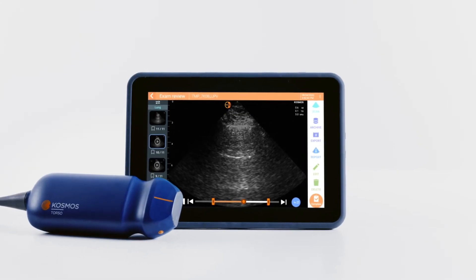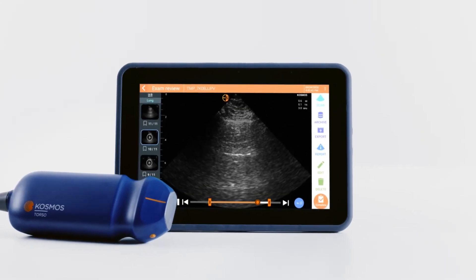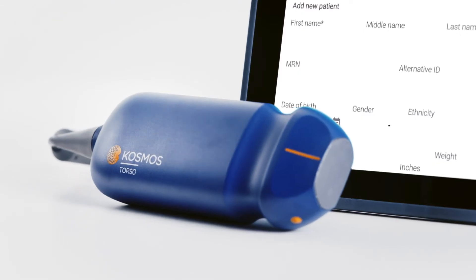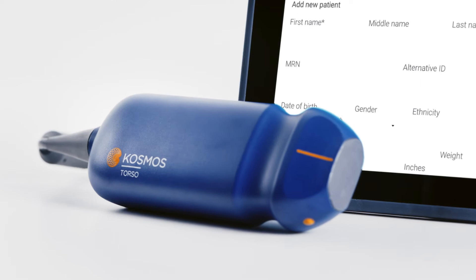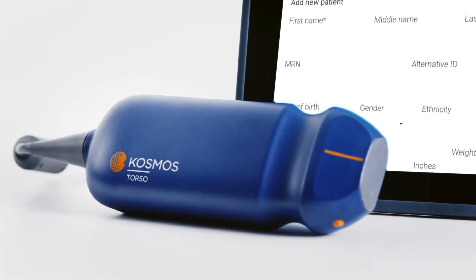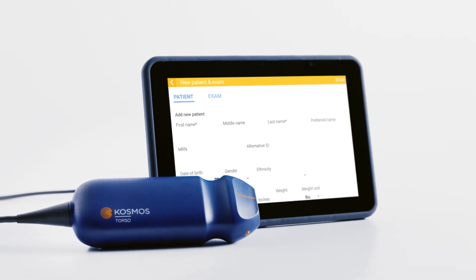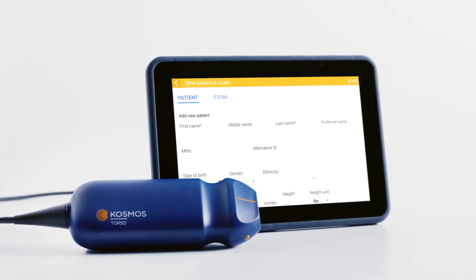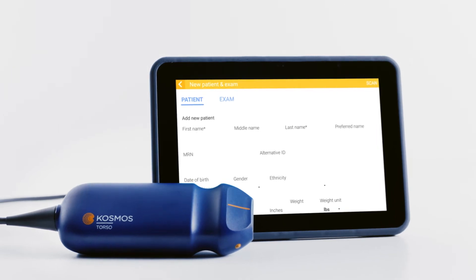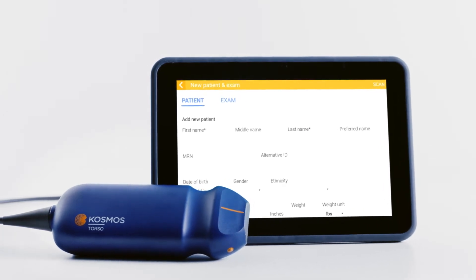In this video, we'll review how to enter patient information and manage exams. Entering patient information at the start of the exam is optional. If you're in a hurry, you can always add new patient information after scanning.